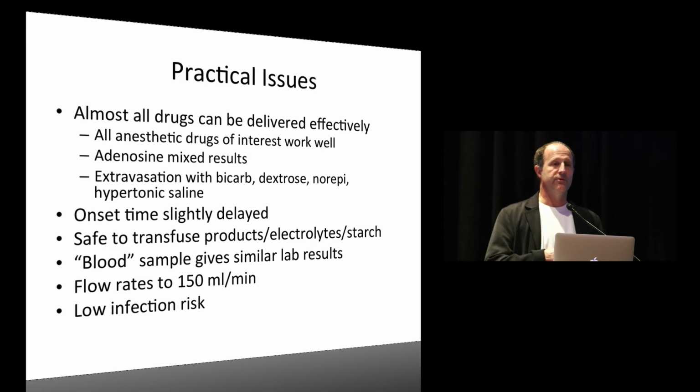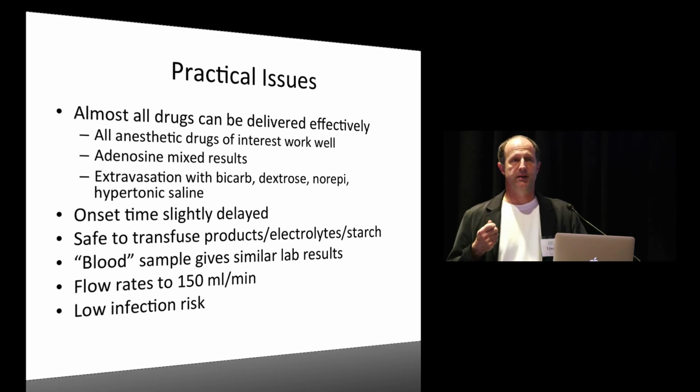And notice how they were actually able to draw blood, or I guess marrow, back through the catheter as soon as they placed it. Turns out that you can use the blood to send to the lab to get things like electrolyte levels, hematocrit, blood gas samples, etc. And it's pretty close. It's not exactly what venous blood would be, but it's pretty close. So it does give you an idea of where you're at, so you can use it in that situation.